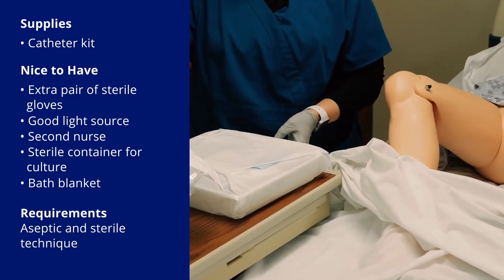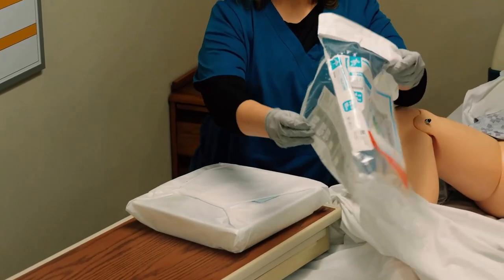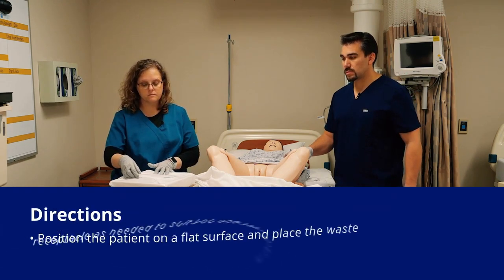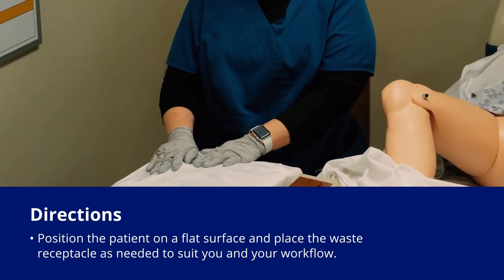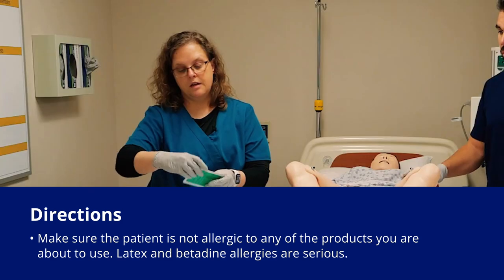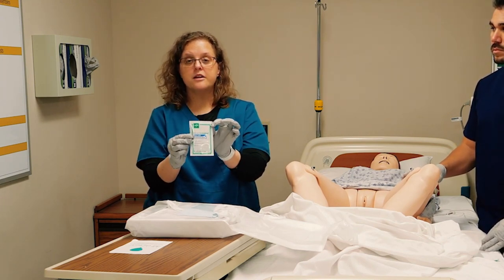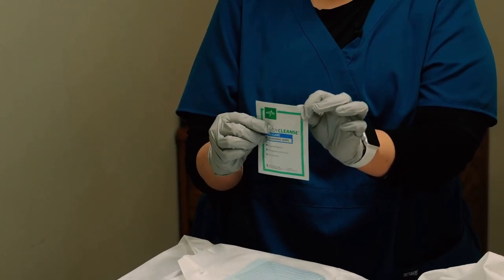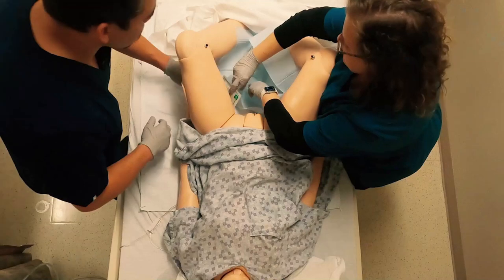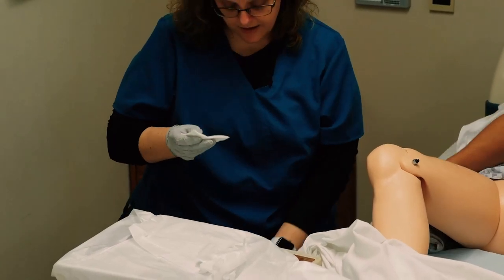As long as you're maintaining sterile technique, there are lots of different ways you could do this. Some people will fold the wrapper at the end of the bed to use as a trash can. Once I start to open this, it's going to be really important to keep in mind what's clean and what's sterile. This kit has a little PeriCare kit in it, and most newer packages do come with this. If your package doesn't have it, you can use a washcloth to clean your patient. This is just a simple waterproof pad. I only need clean gloves for this — it's basically a dirty procedure just to wipe away anything I'm worried about.